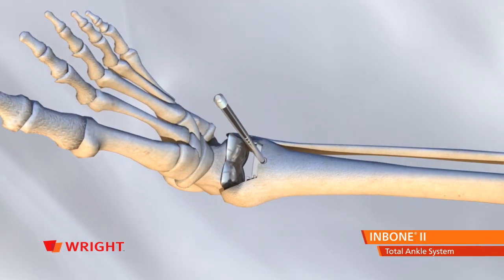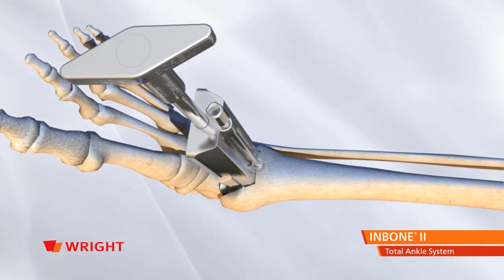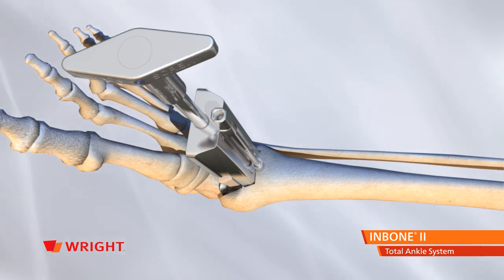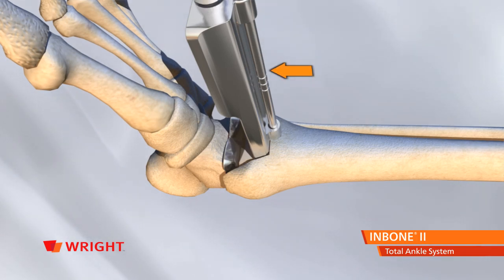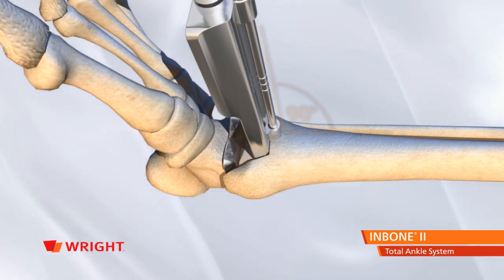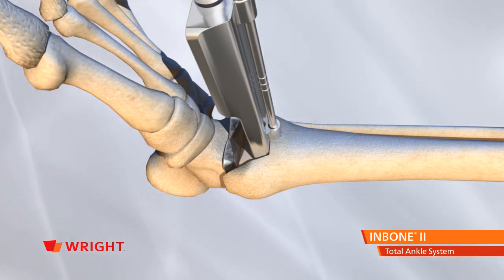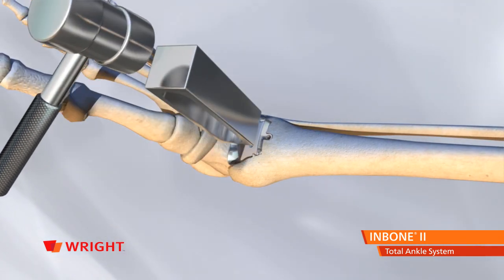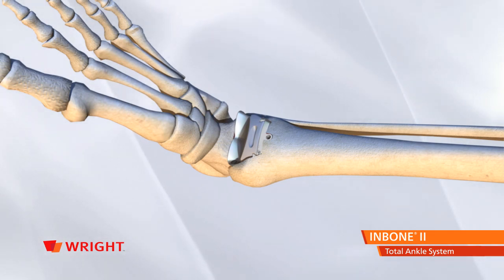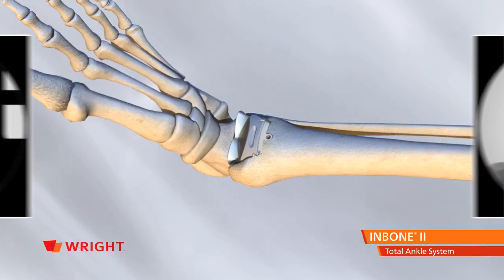Thread the appropriate attachment screw into the tibial tray. Assemble the poly insertion tool and place on the tibial tray. Secure with the attachment nut. Use the jack screw to advance the poly insert implant into the tibial tray. It is important to apply reaction force as needed to keep the insertion tool at a 90 degree angle to the tibia. Advance the jack screw as far as possible. Remove the poly insertion tool, then using the poly impact tool, tap the insert to ensure it is fully seated. Lastly, verify final placement with both AP and lateral fluoroscopic views and close the anterior incision.